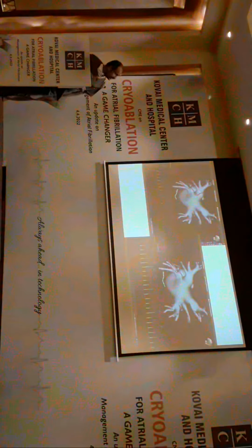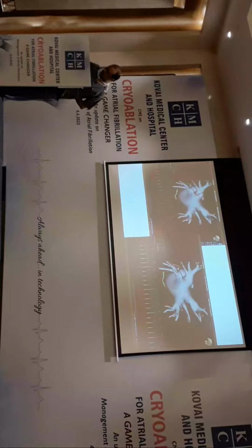That means you no longer have to look in fluoro to move your catheters. You have a proper image of left atrium with you. So you can see here the mapping catheter, which is seen in the superior vein, and the signals are recorded from the mapping catheter. You can clearly see where my catheter is moving by looking at the image.